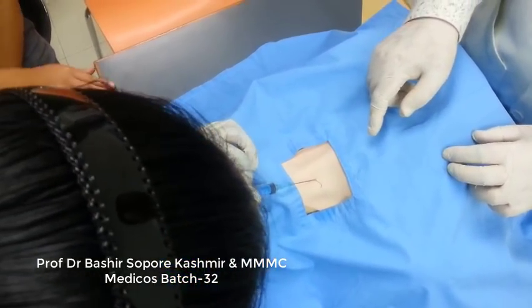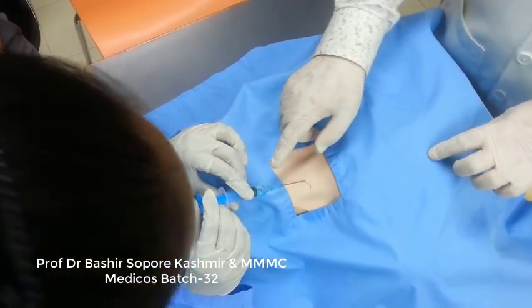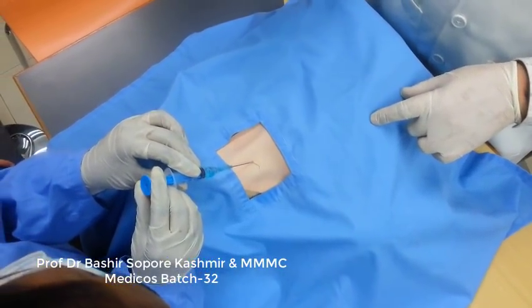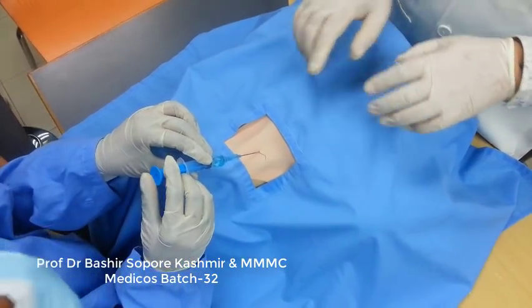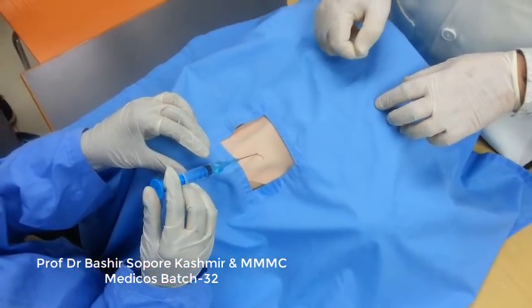Now you can see how to identify venous blood. Venous blood will be dark, while arterial blood will be very bright, and arterial blood is pulsatile, it will come in gushes. So the needle is in the internal jugular vein.